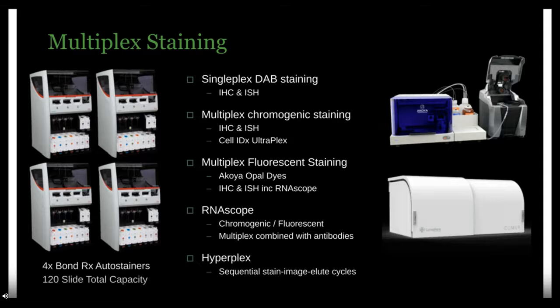We're also currently beta testing the Lunaphore COMET, you can see on the bottom right there, which has a staining module built in, which I'll discuss briefly later. There are other similar products on the market as well.